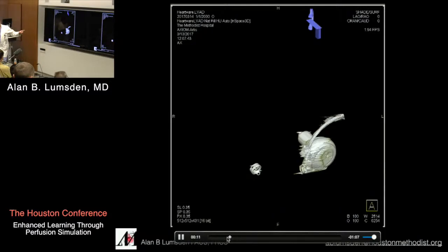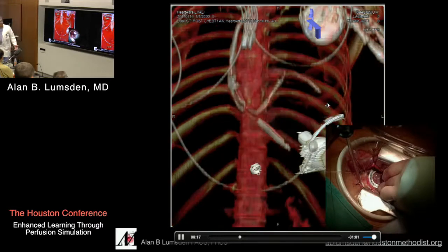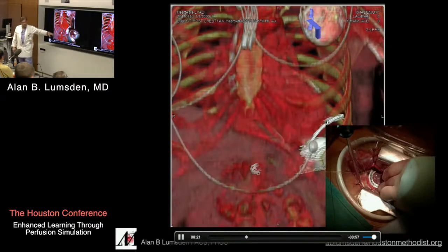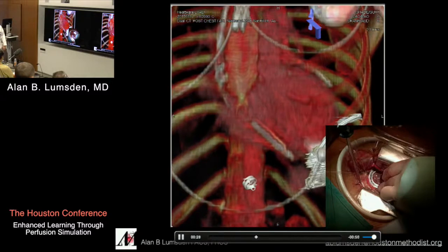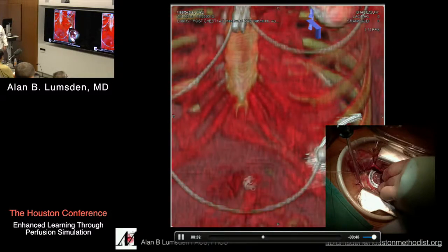There's no incision. We're looking at the device virtually and plan it. Then we're going to plan the operation basically off that. Here's the operation, using these image guidance techniques that I've talked about. This is done with a beating heart. And then we tunnel basically around and sewed it onto the aorta through a little thoracotomy incision.